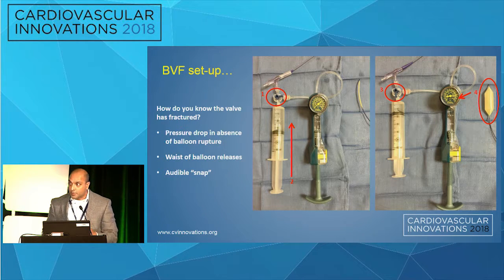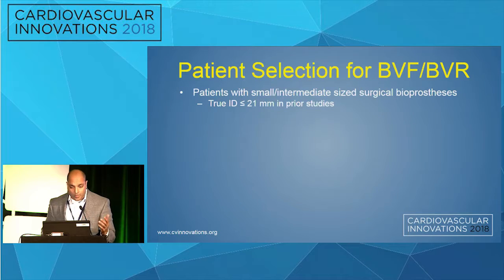Once the pressure drops, you turn the stopcock back onto the syringe, you go negative, you stop pacing, and then you can reassess. Because it is a long pacing run, you have to be cautious. I don't see a timer anywhere.